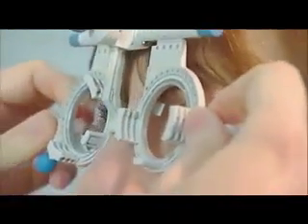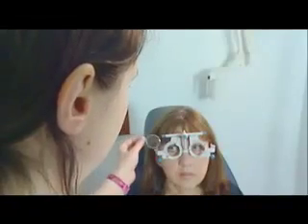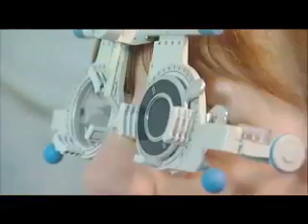The 4-metre test is usually conducted at 4 metres, with the patient sitting or standing and their head maintained at 4 metres from the chart throughout the test. The right eye is tested first, with the left eye covered. An appropriate correction for 4 metres is placed in the trial frame.